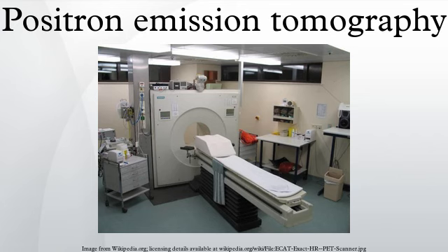Pharmacokinetics. In preclinical trials, it is possible to radiolabel a new drug and inject it into animals. Such scans are referred to as biodistribution studies. The uptake of the drug, the tissues in which it concentrates, and its eventual elimination can be monitored far more quickly and cost-effectively than the older technique of killing and dissecting the animals to discover the same information.